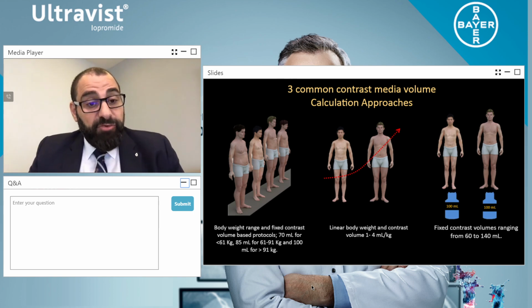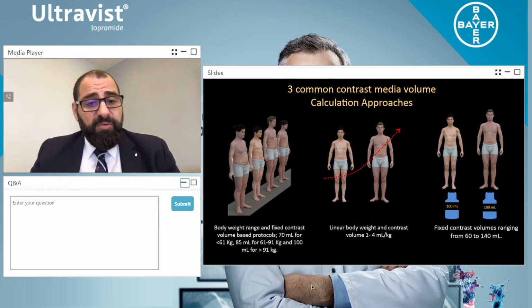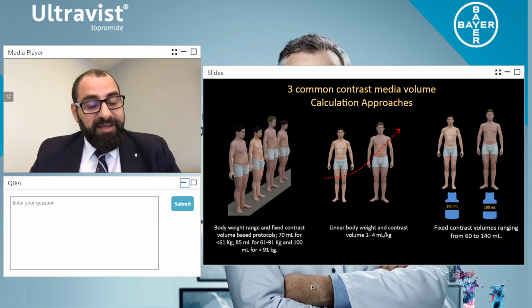And also there are rumors out there about a monomer, which is Ultravist, and then a dimer, which is the competitor, saying which contrast media is safer. To be honest, under all the guidelines and all the research undertaken in the last 20 or 30 years, there has been no direct evidence, because there is no control group to prove which is the safer contrast. The thing is, if the patient is safe to be given contrast due to their hydration status, then we have to look at contrast in a different way.